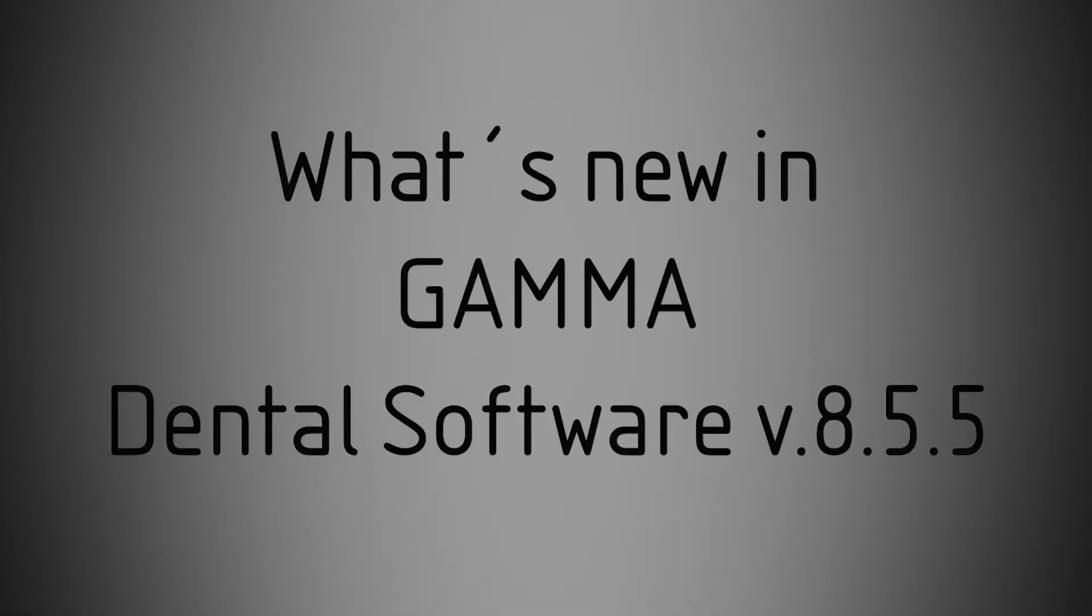Hello and welcome. In this video, we are excited to show you the new and improved features in Gamma Dental Software version 8.5.5.